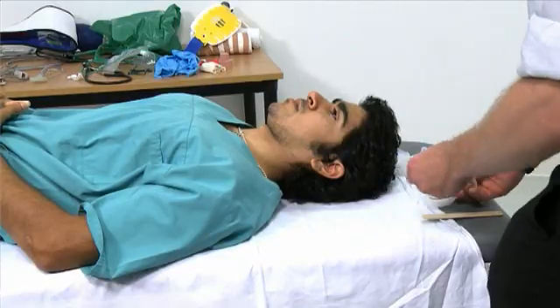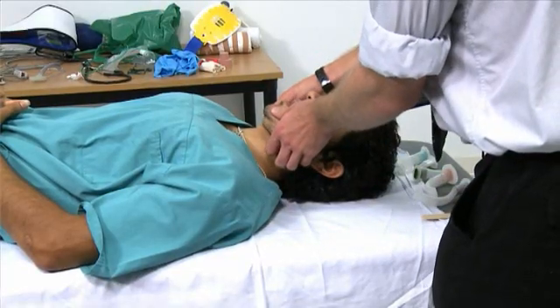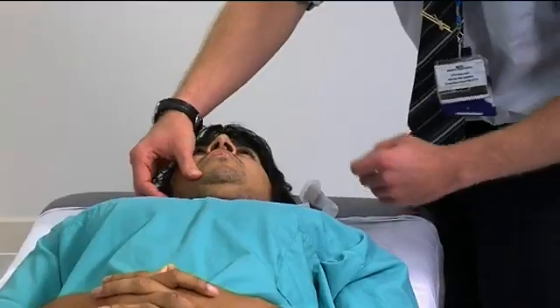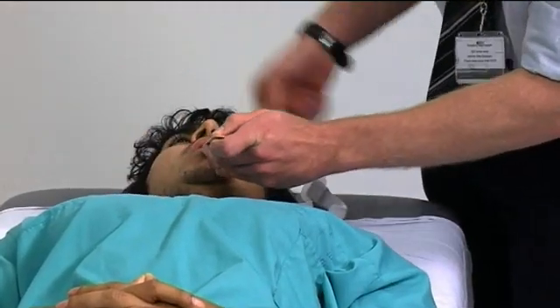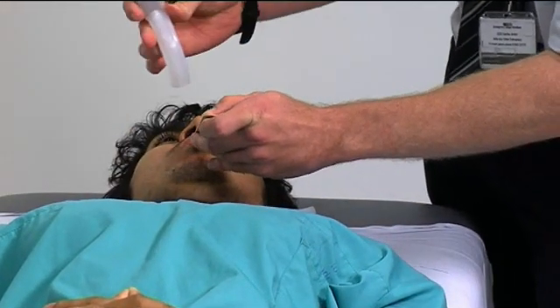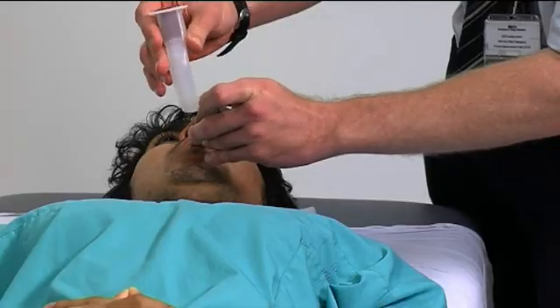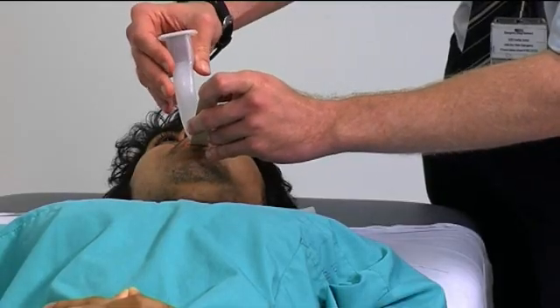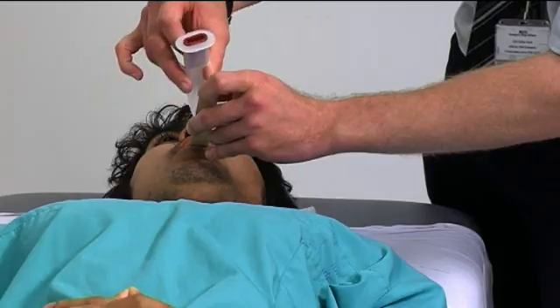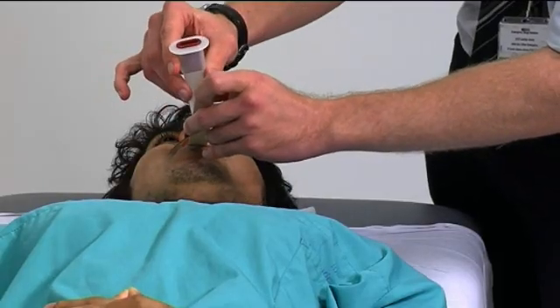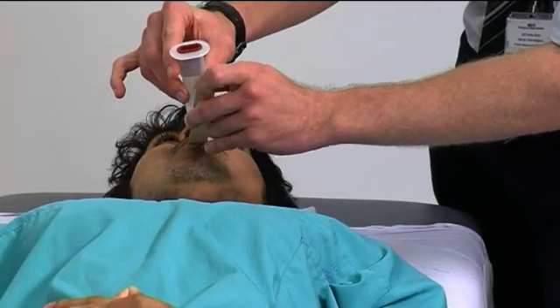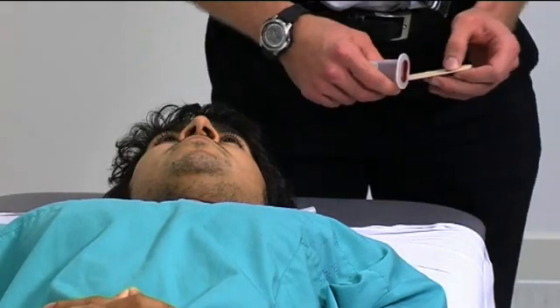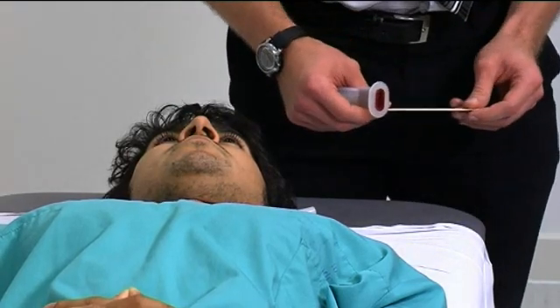To insert it, you'd open the mouth of the patient, use a tongue depressor to depress the tongue, and insert the Guedel airway rotated 180 degrees upside down. You'd insert it and rotate it in a partially inserted position and see if it is tolerated by the patient. If it isn't, then you'd need to consider an alternative airway adjunct.